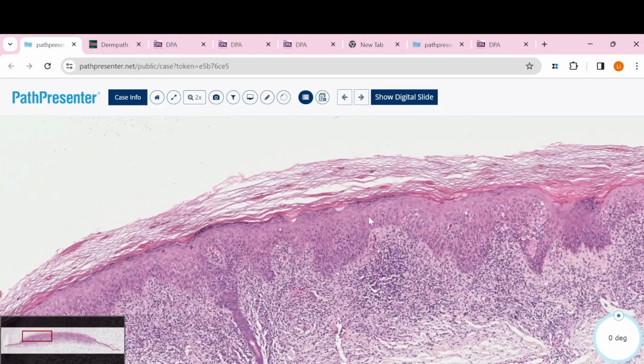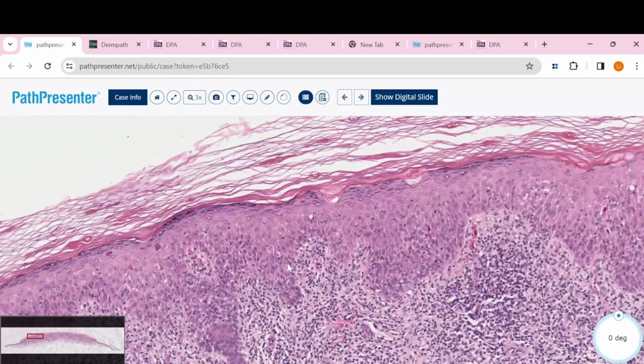That is the pyramid shape of hypergranulosis. That means this purplish cell just forms kind of like a triangle shape, something like this, in the lichen planus, but this one is not really good. Then let's zoom in to see other features.